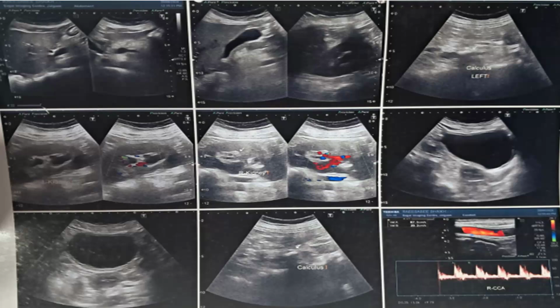Left kidney, there is a... No, the left, just see properly. I think first, in the second row, the first two films are of the left kidney. The right kidney is not showing hydronephrosis. It is the left kidney which is showing hydronephrosis. Yes, sir. Left kidney showing around moderate hydronephrosis. Also, the calculus noted in the left kidney, sir. The size they have not mentioned, and the bladder is moderately distended.